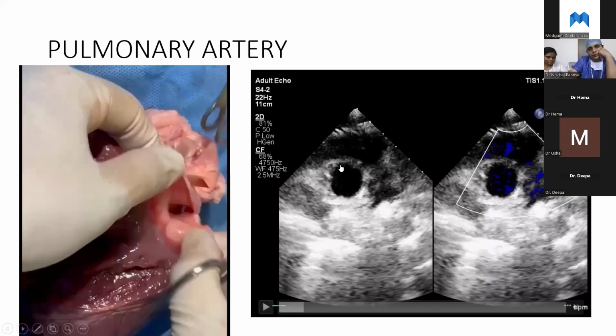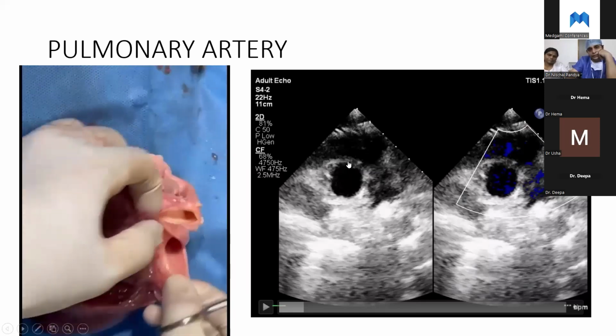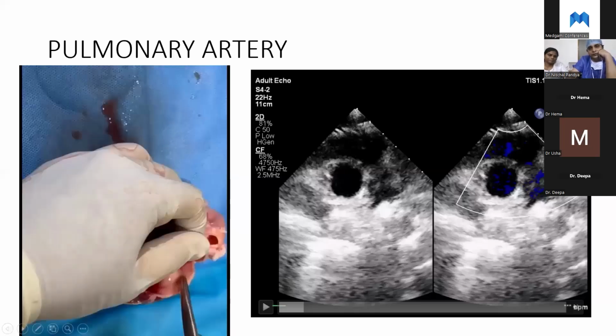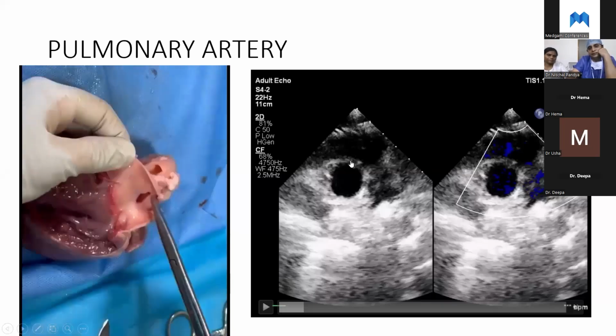So not muscular typically, but again, when you open up and see another view and you're looking at this and you see it extending down, then you could term it that. But in this view, if it's just a defect here, I wouldn't be so bold to call it that.